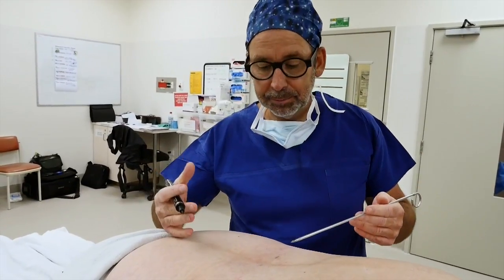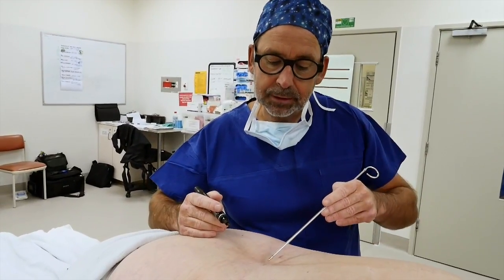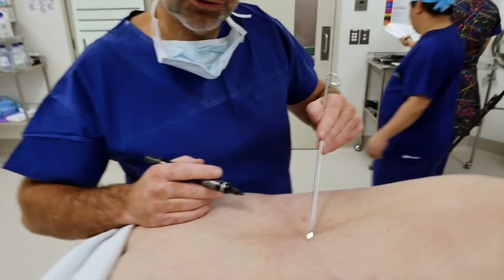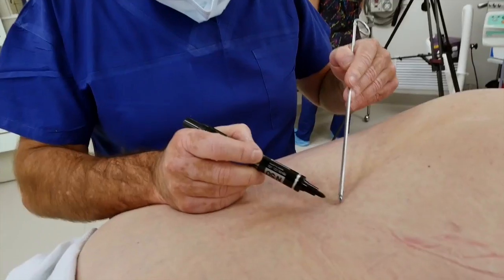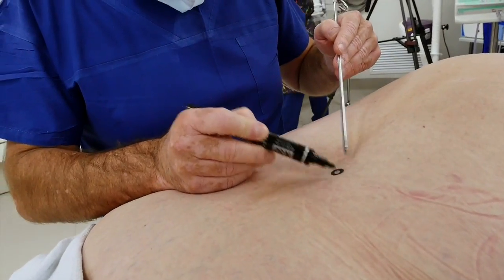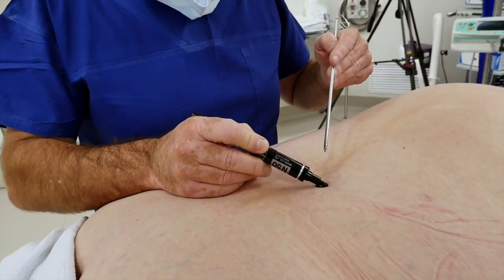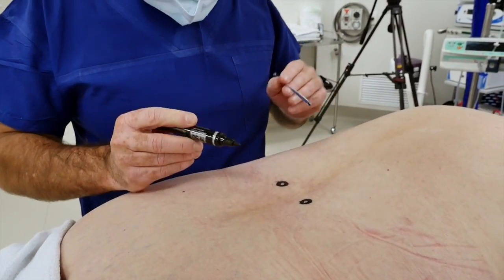For marking up an implant, if you look here you can actually see my suture points for where I went in for her trial. The suture point is right here and right there, so that gives me a good idea before I start where I'm going to need to enter.